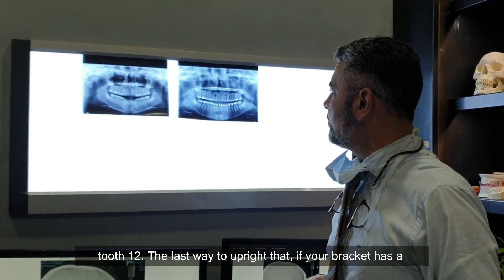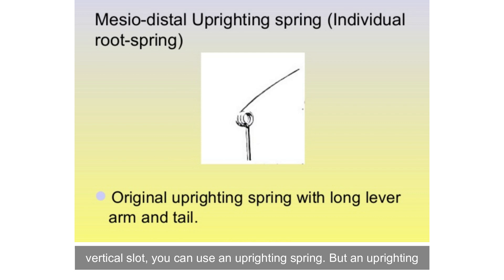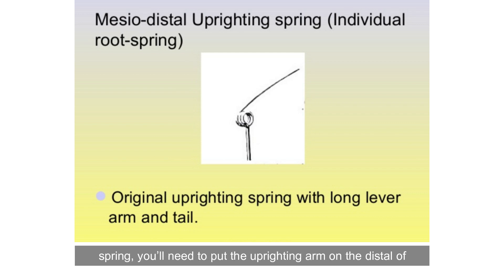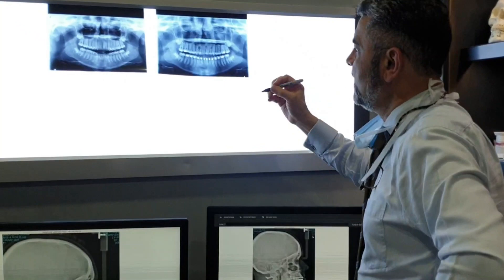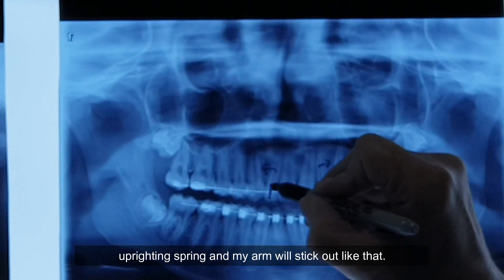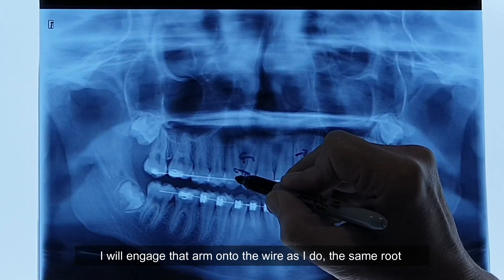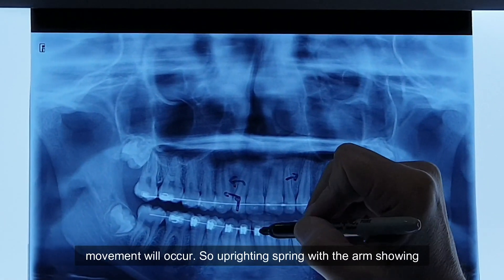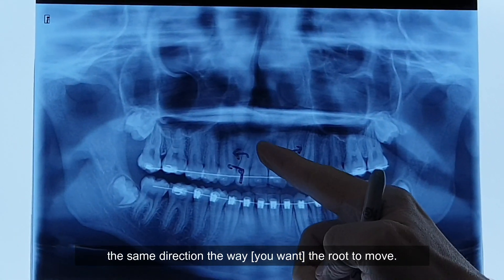The last way to upright that — if your bracket has a vertical slot — you can use an uprighting spring. With an uprighting spring, you need to put the uprighting arm on the distal of the tooth, because the root will move in the direction of the uprighting arm. So if I can show that here — effectively if I have a vertical bracket slot, I can drop in my uprighting spring and my arm will stick out. I'll engage that arm onto the wire and the same root movement will occur. So the uprighting spring arm shows the direction the root will move.